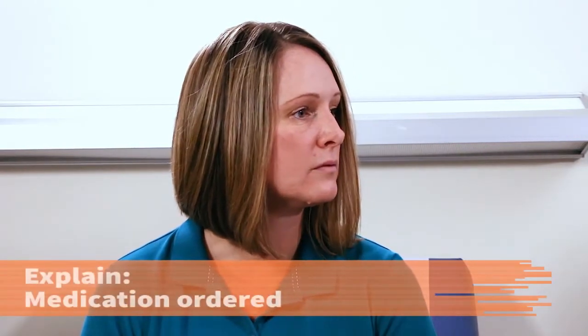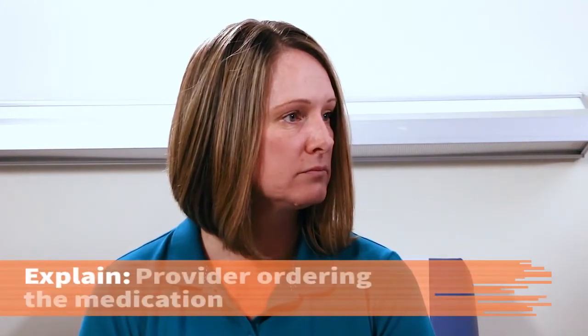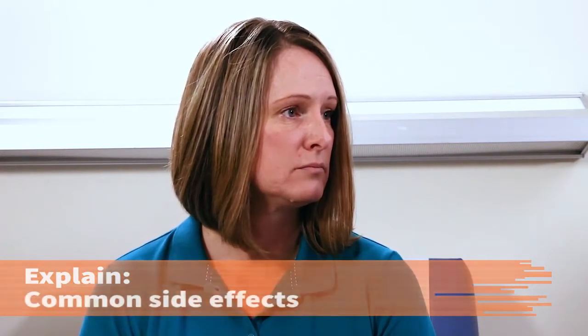Provide the right education to the patient. Explain the medication ordered, provider ordering the medication, the desired effect, and common side effects. Answer any questions the patient may have. Use language the patient can understand. Tina, Dr. Anderson has ordered a TB injection for you. It's a 1/10 of a milliliter of tuberculin right up under the skin.